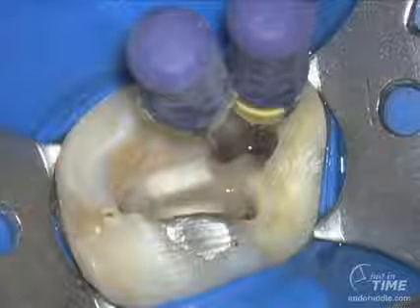Well, if we look at the post-op, the endodontics is straightforward, but I want to just point out, look at the axial walls. They're flat. Notice that the access cavity has been expanded to remove the triangles of dentin, and notice that we have good shape flowing through the canals exhibited by the obturation right to the terminus of the three systems. Notice how the MB1 and MB2 merge in their apical extent.